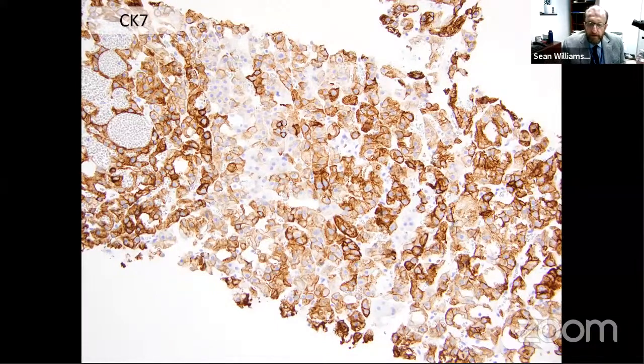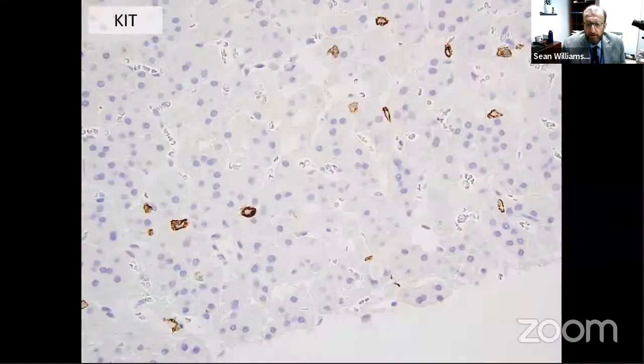And so if you routinely use immunohistochemistry in oncocytoma, you'll know that cytokeratin 7 is consistently very minimal in oncocytoma. Some authors might say negative, but to me, the typical pattern of cytokeratin 7 in oncocytoma is labeling of basically scattered individual cells. But in these tumors, although they're very bland and oncocytic looking like an oncocytoma, they have very consistent recurring diffuse CK7 positivity, which is unusual.